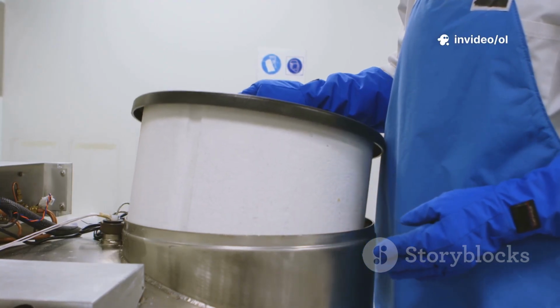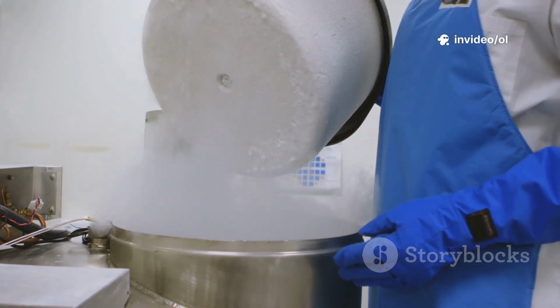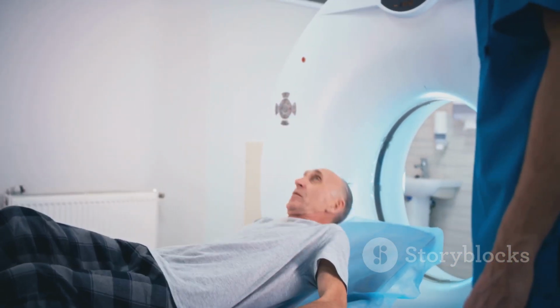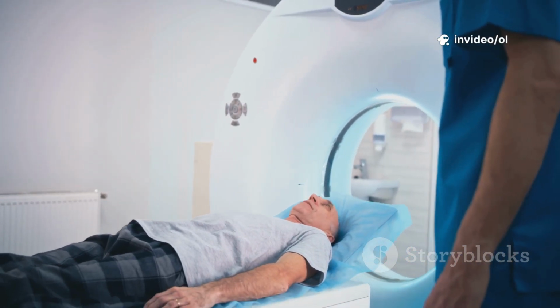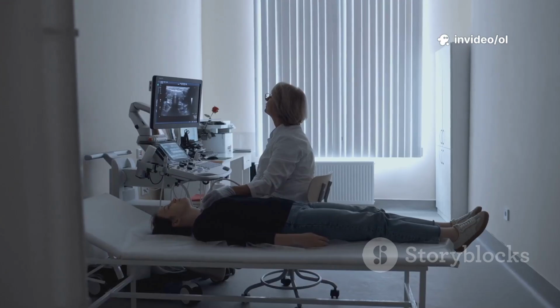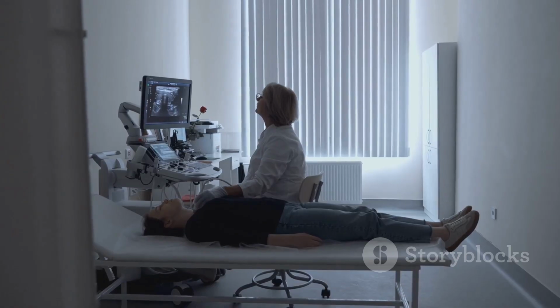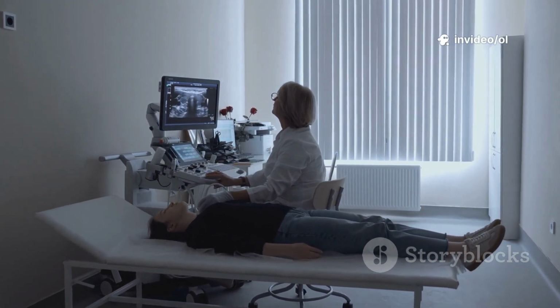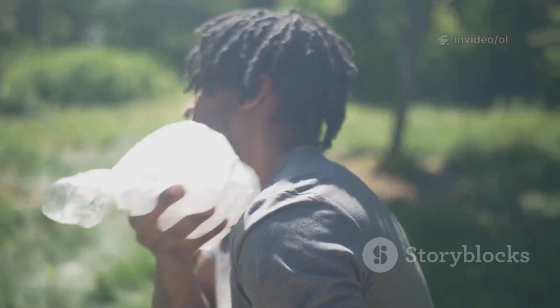There is also a more advanced version called micro-TESE, using a powerful operating microscope. The microscope magnifies testicular tissue and reveals the tiny tubes where sperm is made. They can identify the healthier, fuller-looking tubes more likely to contain sperm. This is especially helpful for non-obstructive azoospermia, where production is very low and patchy. Micro-TESE maximizes the chance of finding sperm while removing the smallest amount of tissue necessary. TESE and micro-TESE often require deeper sedation or general anesthesia. So that's basically the distinction.